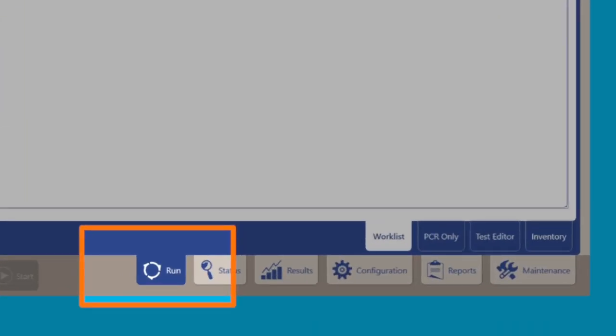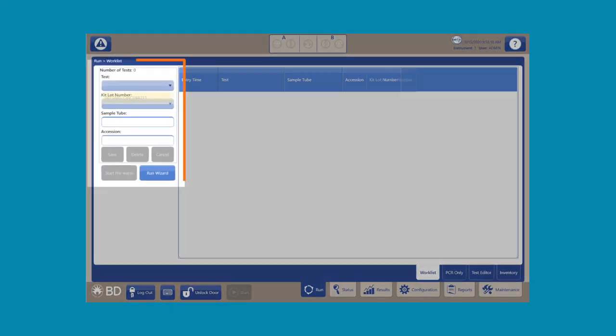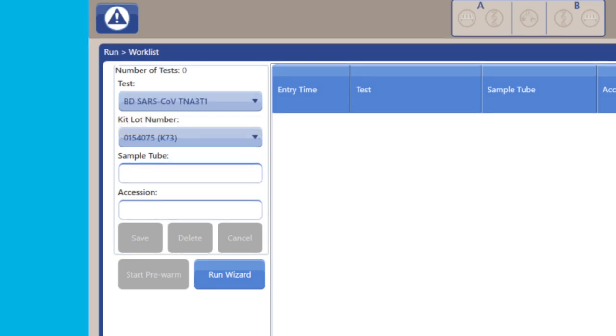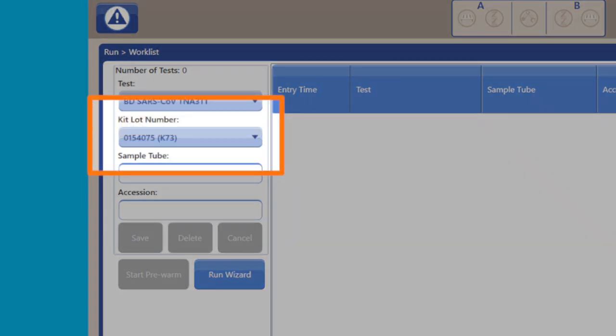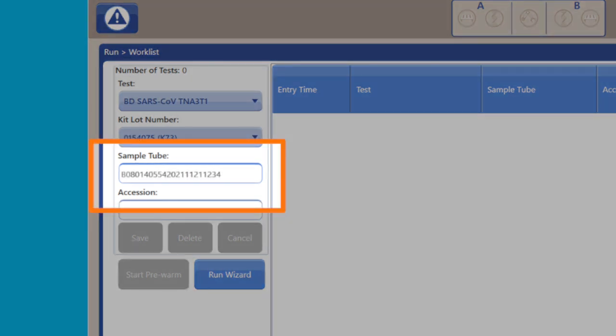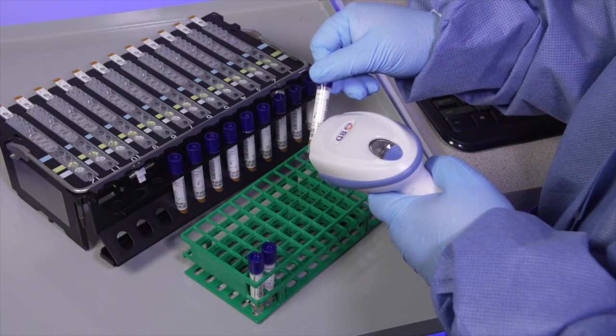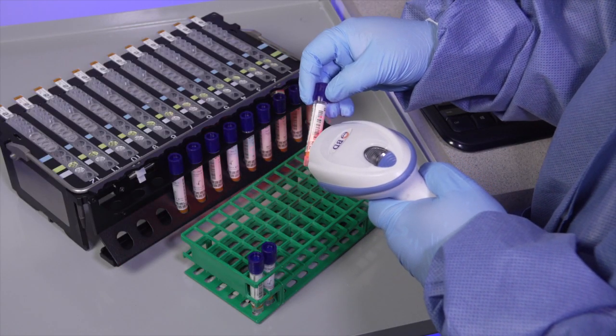Navigate to the work list by selecting the Run tab. Using the pull-down menu, select the UDP previously created, for example, BDSARS CoV-2 TNA-3T1. Select the appropriate kit lot number found on the outer box from the pull-down menu. Enter the sample buffer tube ID, patient ID, and accession number, if applicable, into the work list, either by scanning the barcode with the scanner or by manual entry.